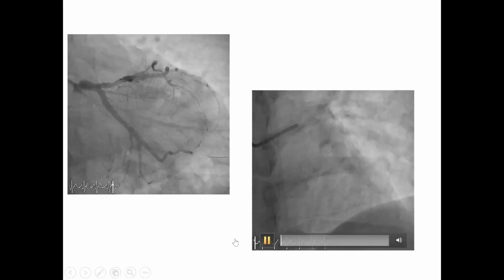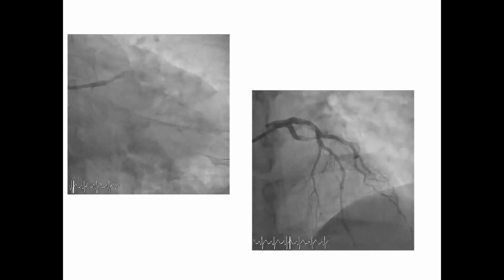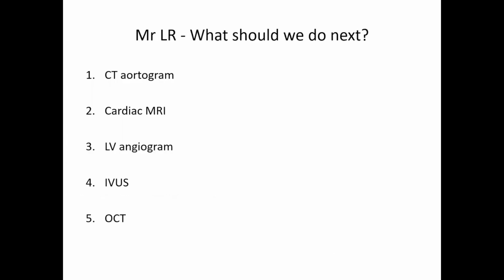Okay, so right was fine, and all the arteries were open, patent, flowing. What territory was the ST elevation? Anterior. So that's my next question. I don't know whether we can run it, but obviously what you would do depends on what you think is in your mind. The poll number 3 questions. Yeah, I can match it now.